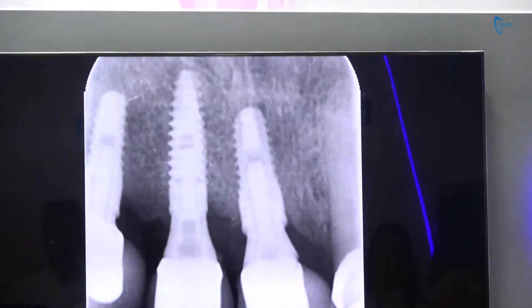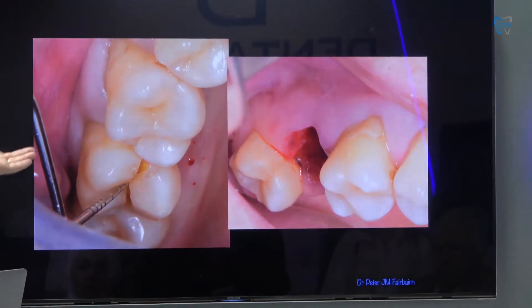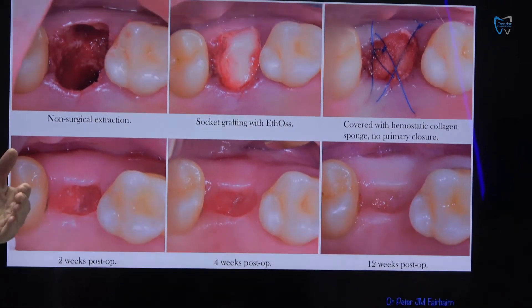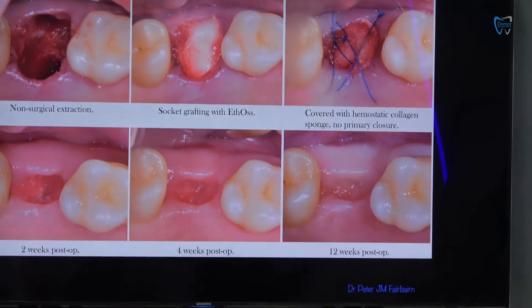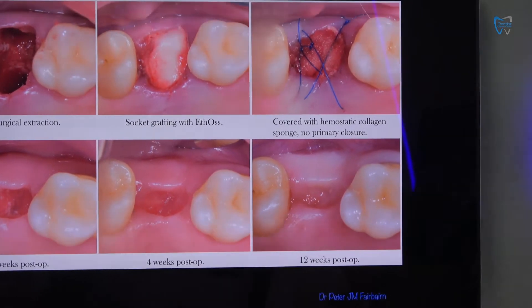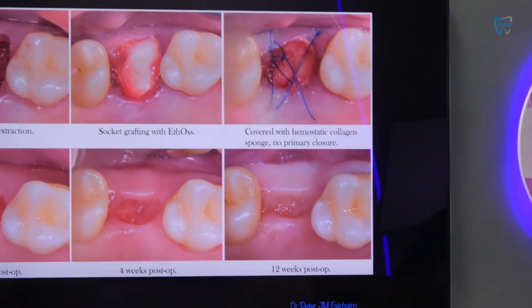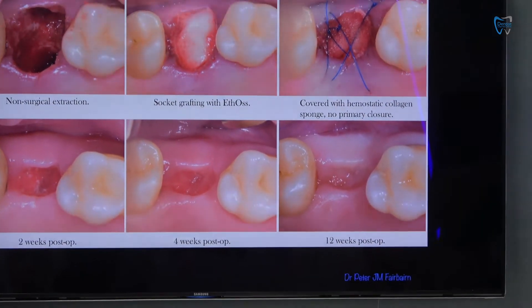And I'll show you the histology as to why that happens. So there it is, and we've got an adequate outcome. We can look at a case like this — we've got a root fracture, you can see. We're going to remove the tooth, clean the site very well. I'm going to socket graft now. For improved success, I like to rather take the tooth out, let it heal for three weeks, then socket graft, and then you'll get 99% success. If you do it simultaneously, especially on the upper, there can always be an opportunity that you may lose some graft material in some patients. So we've done it this way just to show it during this course. We've grafted the socket and sutured it with a collagen sponge just to help with a clot. And here it is two weeks post-op, four weeks, and you can see it's healing by secondary intention over a stable graft material.